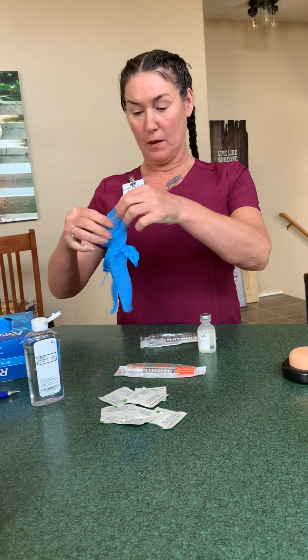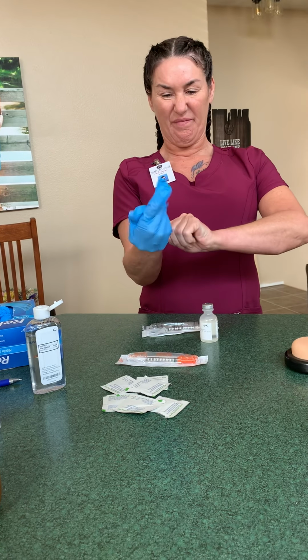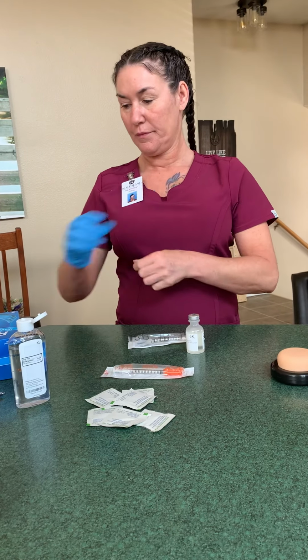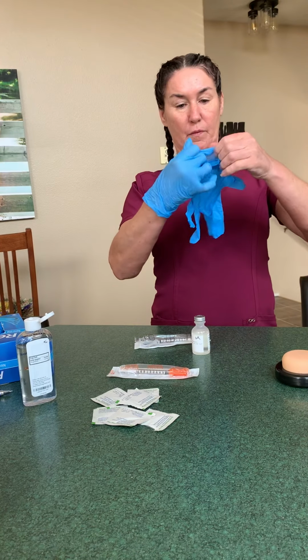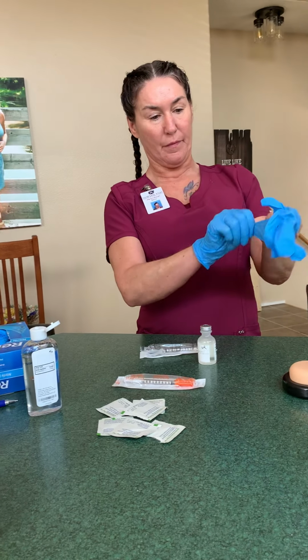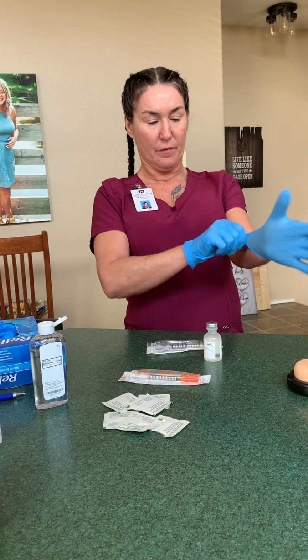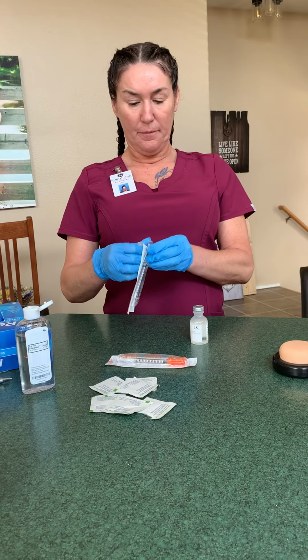I'll start by washing my hands and gloving them. And we're going to prepare our needle.